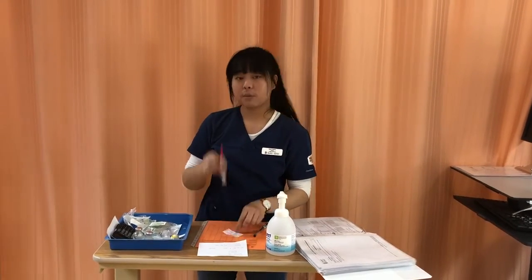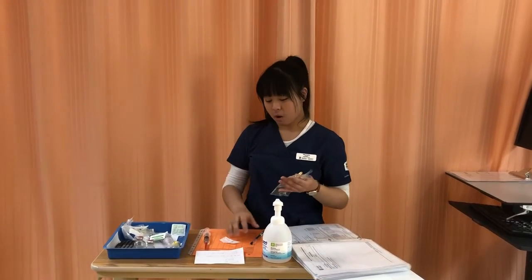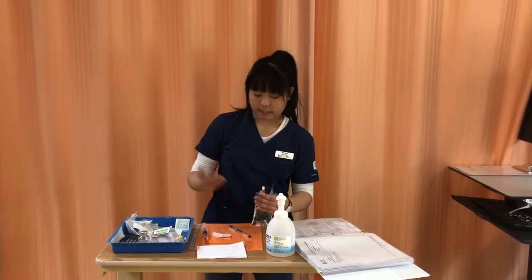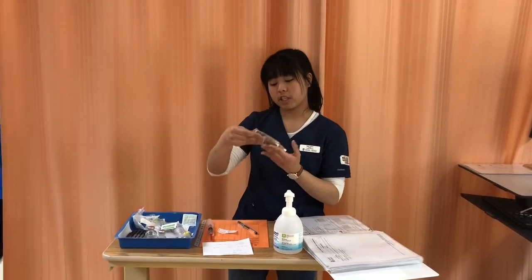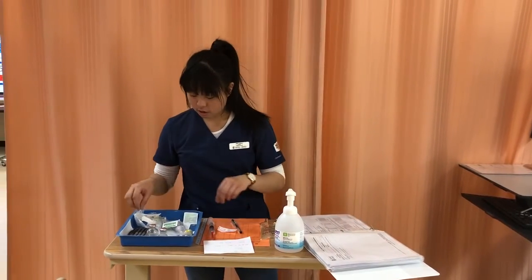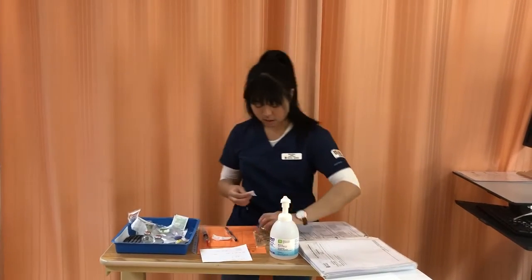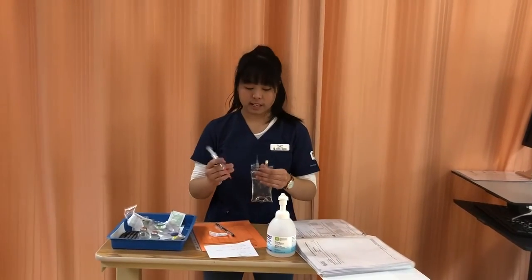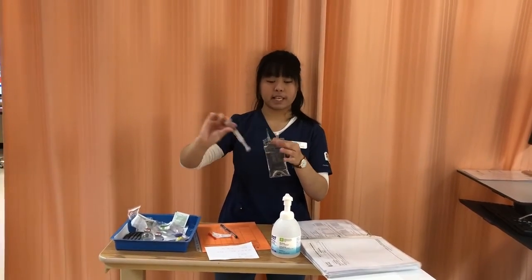But before I do that, actually, I would have to dilute it first to my mini bag. And so I have my 100 ml mini bag in here, which I have chosen, as I said before, because it's the patient's first time getting this medication, so we can intervene if any of those side effects occurs. So first, I'm gonna check the integrity of the bag. There are no floaties or anything, so we're good to use it. And so first, I will be doing my alcohol swab right here. Swab it for 30 seconds, let it dry for 15. Like so. And then I will be injecting it into my port while maintaining sterility as well.